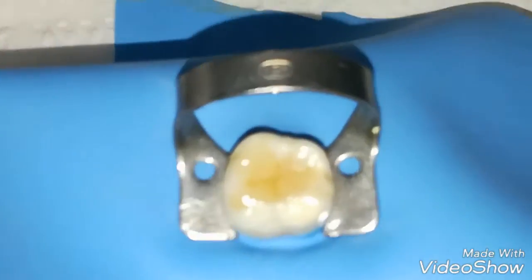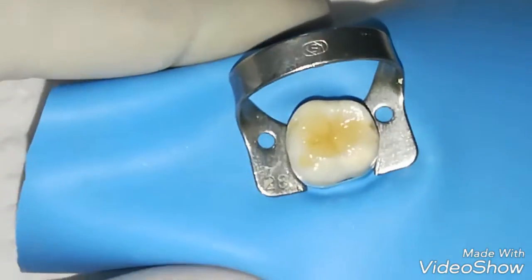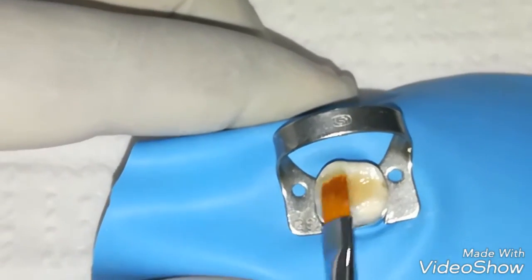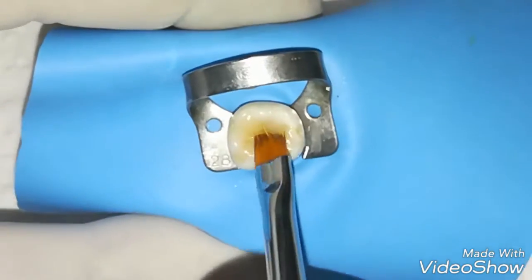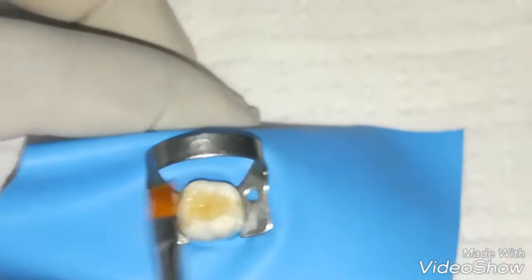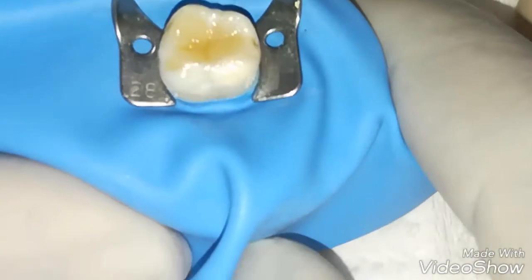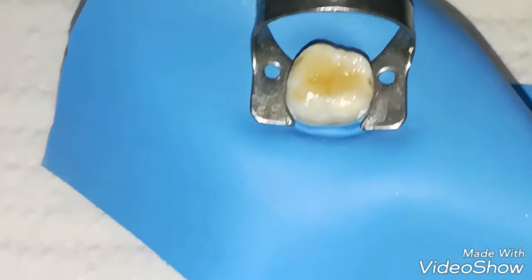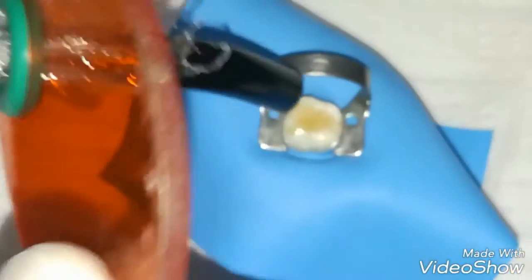There is no need to make over-contoured pits and fissures because the patient restoration is nearly complete — most of the part is done perfectly. After some brushing and smoothing each and every part from center to cusp, you can see the perfect balancing of the occlusion and the glazing effect of the heated composite. Now we are going to cure it for 20 seconds.